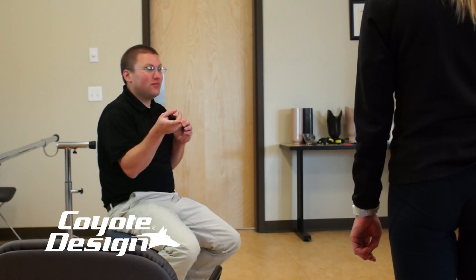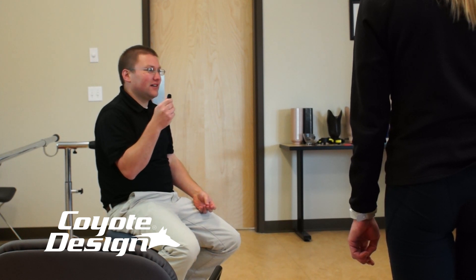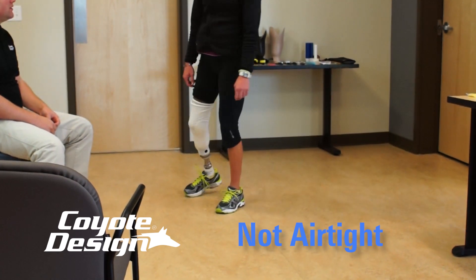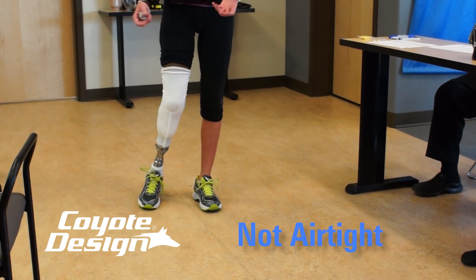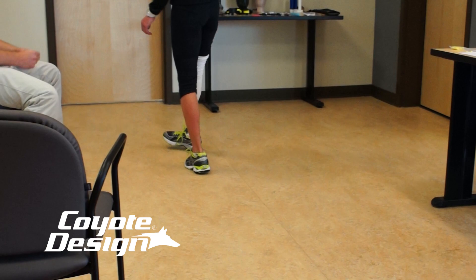We're going to get her input on what it feels like when we let air in the bottom of the socket. I can feel it move around more. It feels like air is basically going in it. How does that? I don't like it. Put it back in.